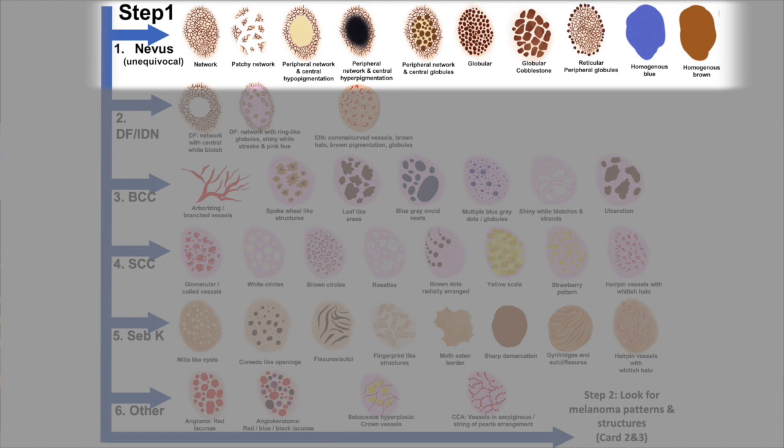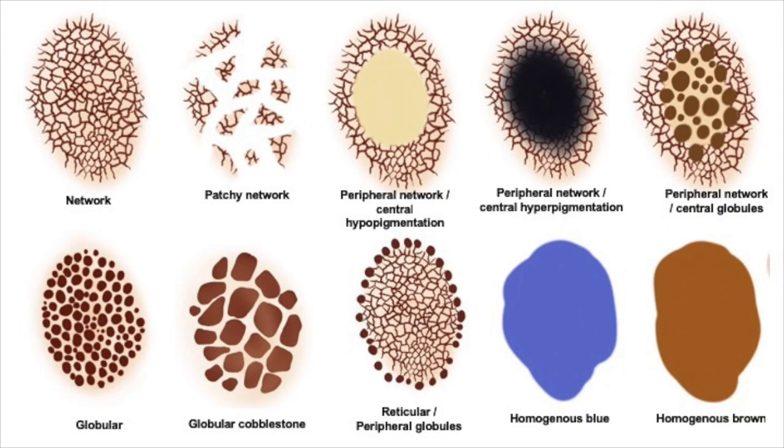They are mild to moderate dysplastic nevi, but they are benign, okay? And so now, it's sort of this idea of a beacon in darkness. All of these lesions that we didn't really know how to classify, we now know that there is this one group of melanocytic neoplasms that we can confidently say are benign, okay? And that's in line 1. So what are those benign nevi?